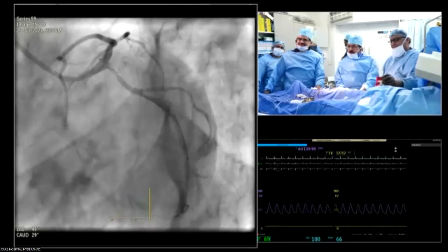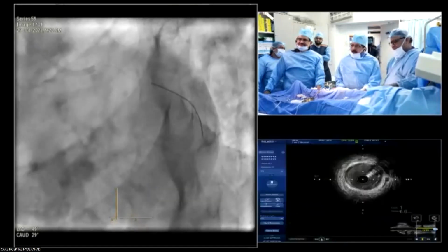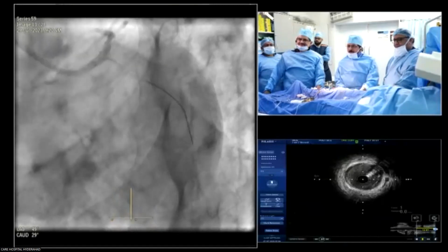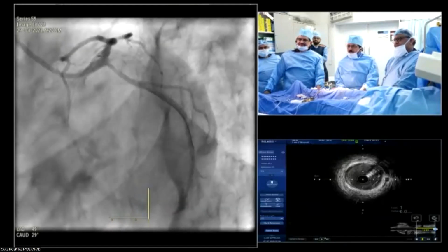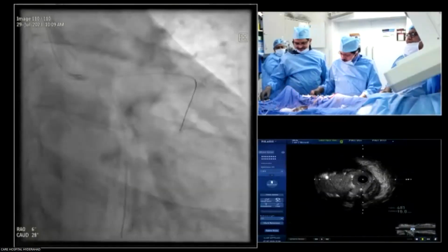So you've got a proximal circumflex lesion. It's a modest to large size circumflex, with at least 2 obtuse marginal branches. The lesion is very proximal in the circumflex, without a ton of retrograde collateralization from that territory. So this patient is living largely on retrograde collaterals from the LAD into the RCA prior to recanalization, and you've got a tight circumflex.